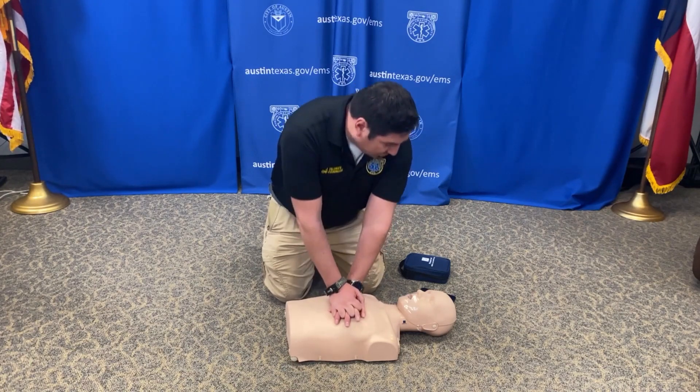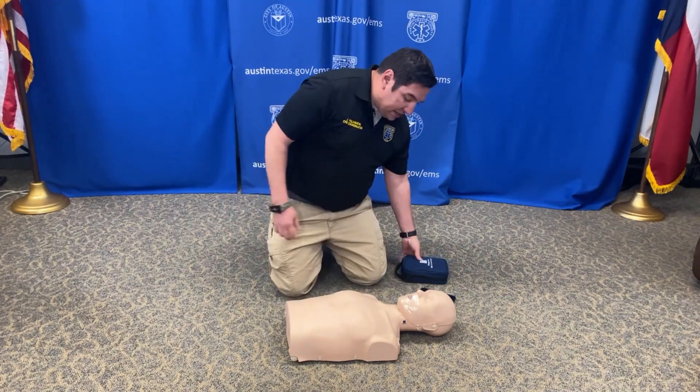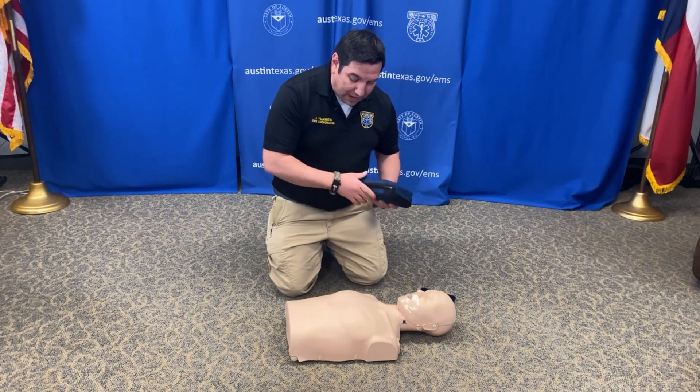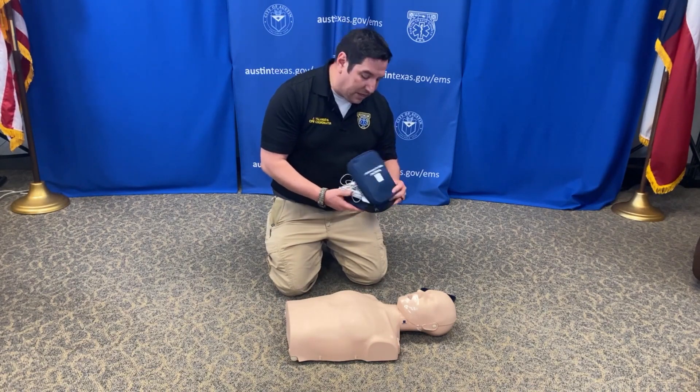And maybe at some point your dispatcher will tell you — if you are alone — to go ahead and stop compressions and apply the AED. So we're going to stop. But if there were more people here, I could continue to do compressions and somebody else can apply the AED on our patient.